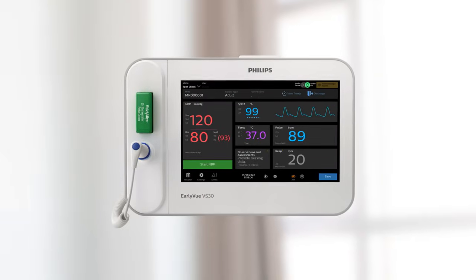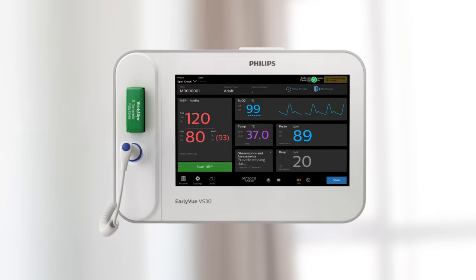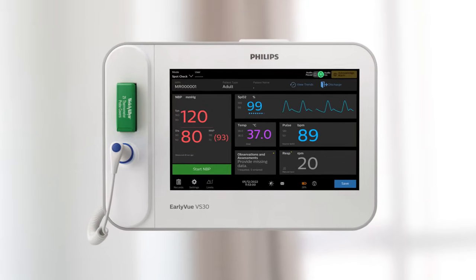The Philips EarlyVue VS30 allows you to easily collect critical vital signs for adult, pediatric, and neonatal patients.